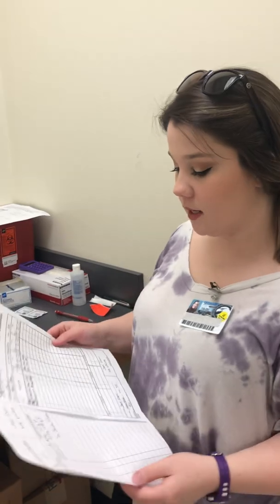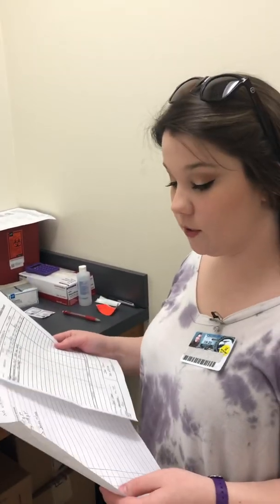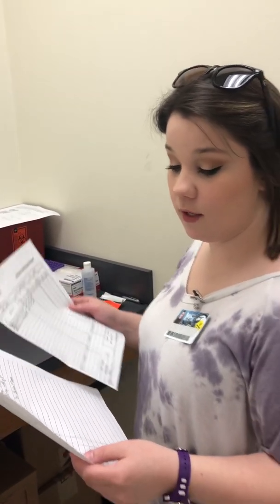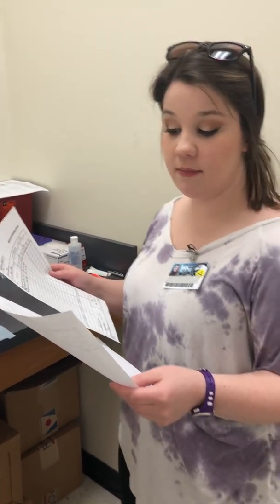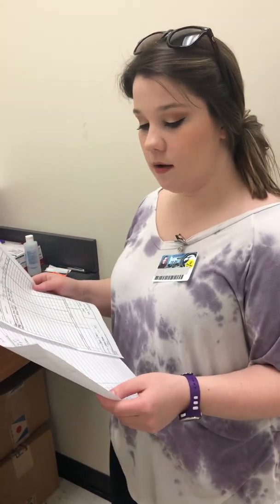I'm going to start off by comparing my doctor's orders to my MAR. It says here that the patient's name is Janet Green, which is correct. The medication that I'm giving right now at 8 o'clock is gentamicin. The dose I'm giving is 80 milligrams, and the route I'm giving is IV piggyback. It's going to be every 8 hours, and the time is now.